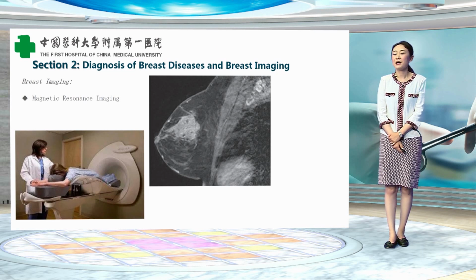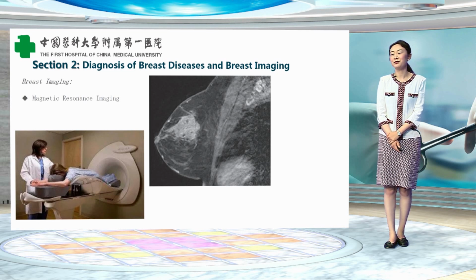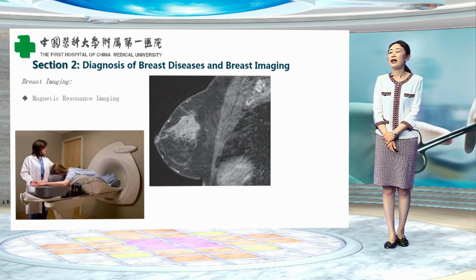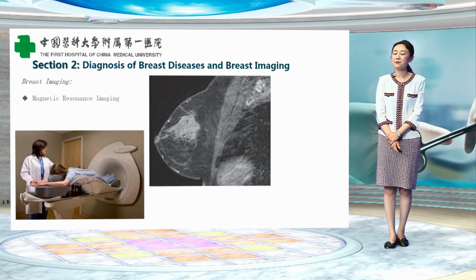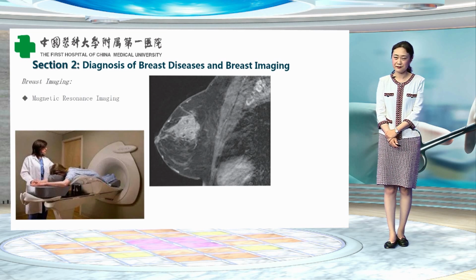The figure of breast MRI showing gadolinium contrast enhancement of a breast cancer. The rapid and intense gadolinium enhancement reflects increased tumor vascularity. And lesion extent and size may also be assessed by MRI, and it gives a more accurate estimation compared to the sonography.